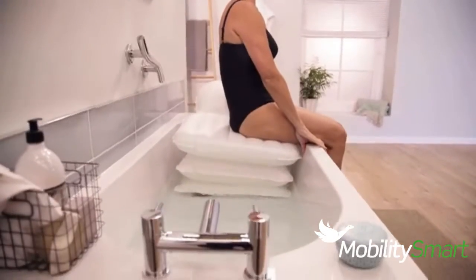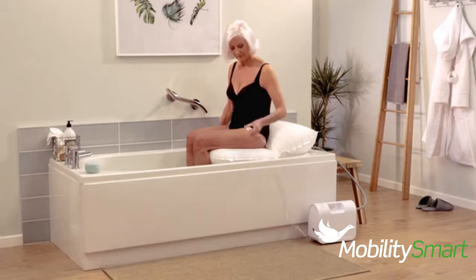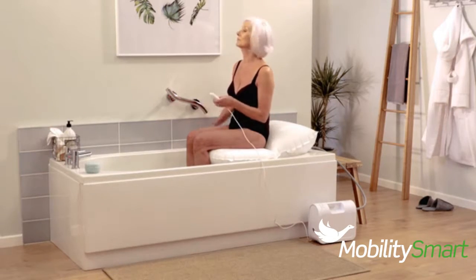Simply lower yourself onto the seat with your feet still on the floor. Then, holding onto the side of the bath, slowly turn and lift your legs one at a time into the bath.